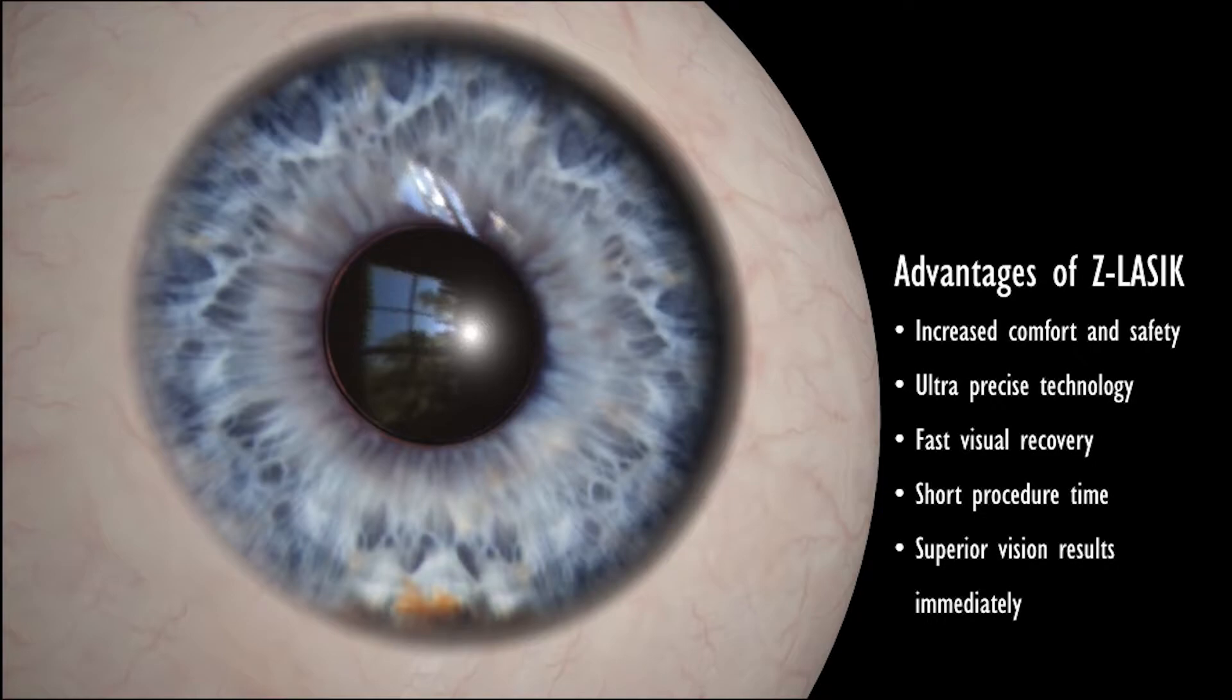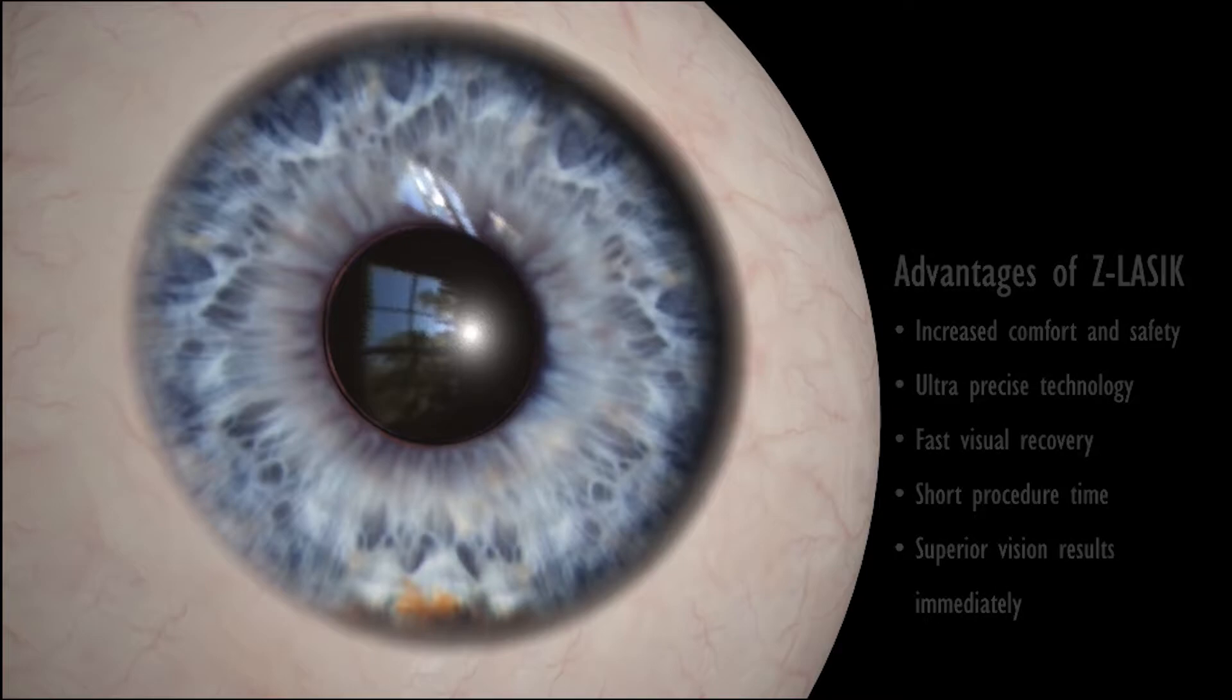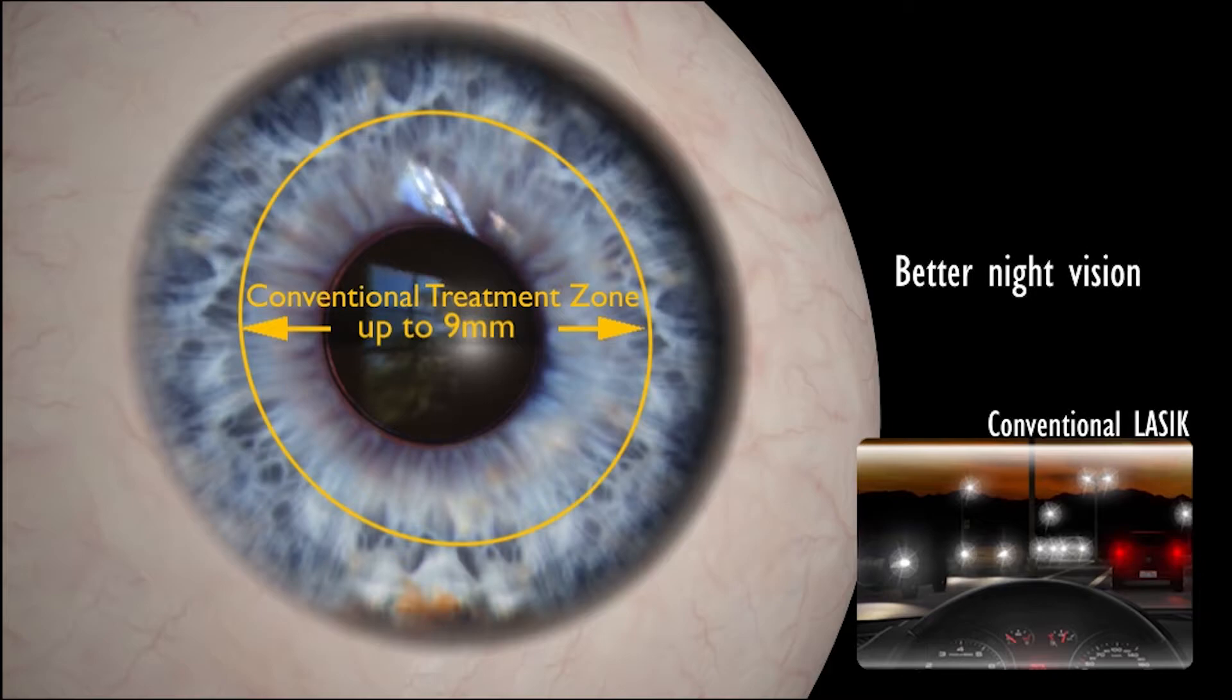The procedure takes only a few minutes and most patients notice dramatic improvement of their vision immediately. With Z LASIK, your surgeon can apply the vision correction to a larger area on the cornea.